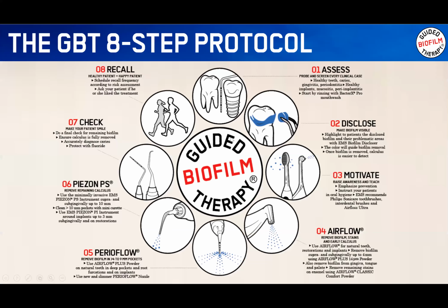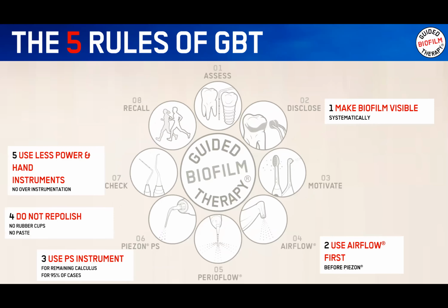Why? Because we're gonna remove the biofilm, stains, and young calculus. Then we can use PerioFlow for periodontal patients or patients that have some dental implants. We go to the Piezon PS. This is a really thin insert that goes up to 10 millimeters, and we're gonna only use it in the areas that have hard calculus. We're gonna check. If we see that we missed something, we can revisit. Otherwise, it's good, and you can fix the recall with the patient.